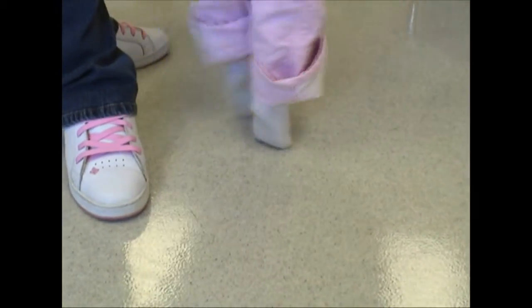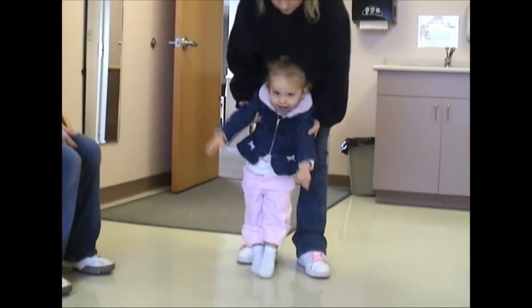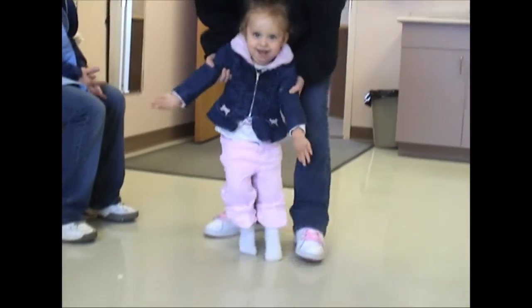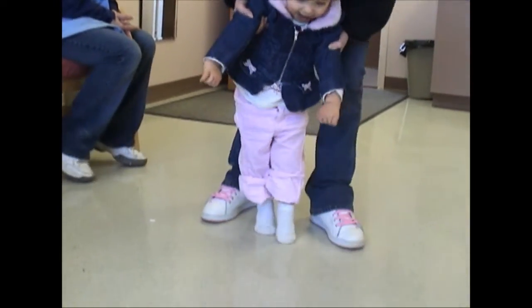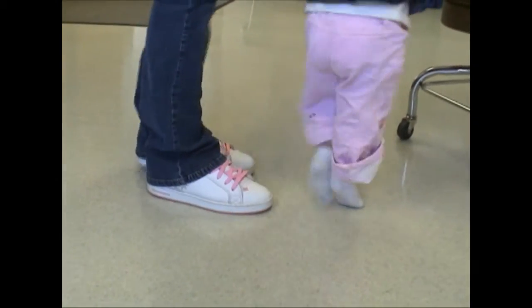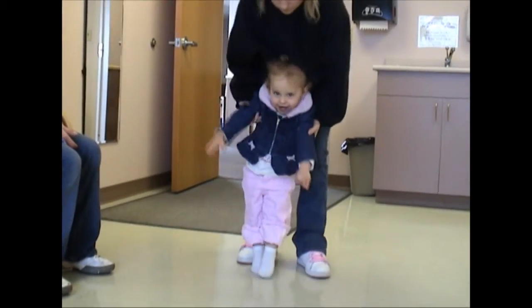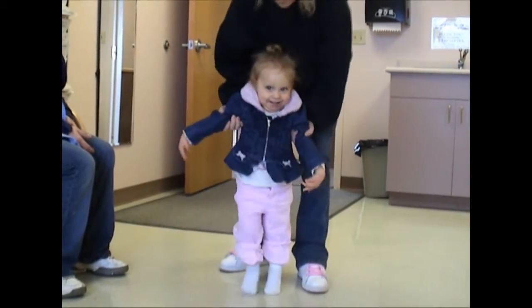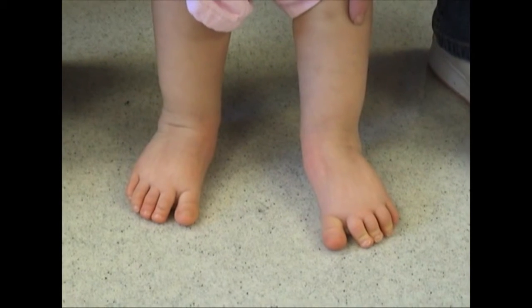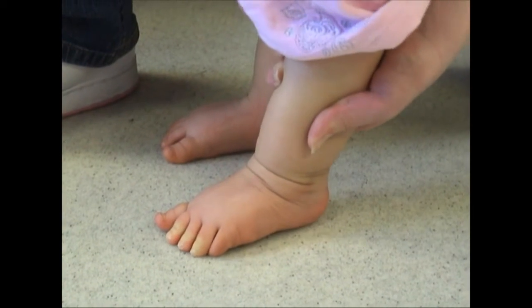As you can see, she is a consistent toe walker and exhibits a lot of plantar flexion and extension tone, both in her lower and upper extremities. As soon as she begins to ambulate or move, her extension tone becomes accentuated and makes it difficult for her to even control her upper extremities. She does have passive range and her mom can actually get her to stand flat-footed, as you can see here.